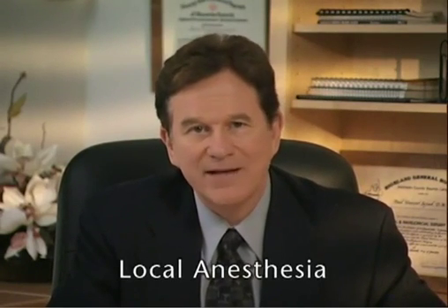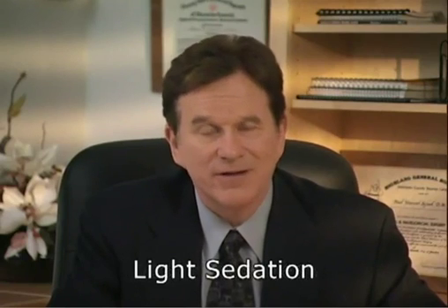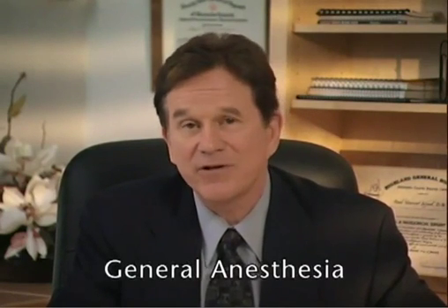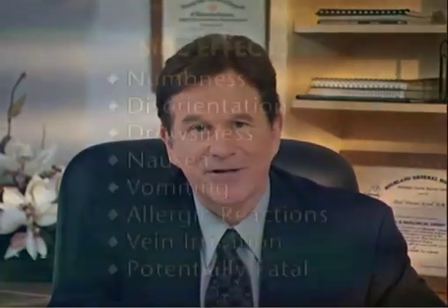Dental implant surgery can take place in either the oral surgeon's office or in a hospital setting. The surgery in the office is generally performed using a combination of local anesthesia and light sedation. Occasionally, general anesthesia is used, and the patient is not conscious during the surgery. The usual side effect of local anesthesia is a few hours of numbness following surgery.